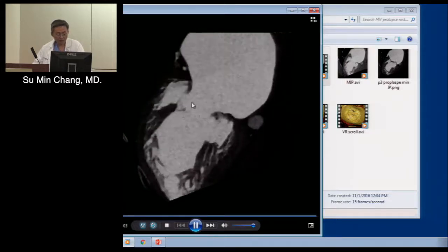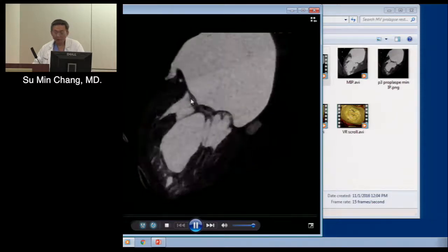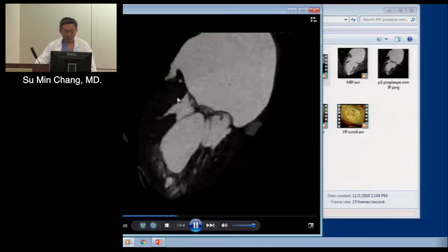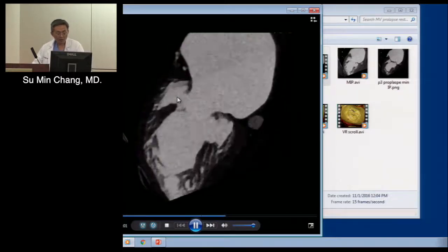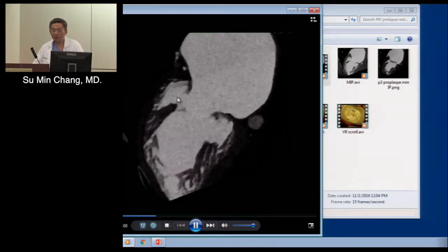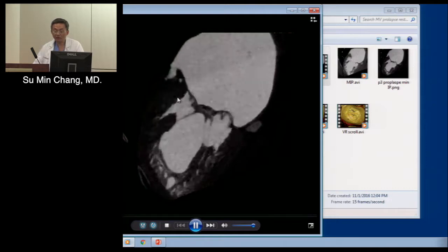This is rare, but one of the best examples we have, where you can even see the chordae. Someone is nodding their head because I think I gave her this picture. This is important because for mitral valve assessment, the limitation we have with echo, or the TEE especially, is that the subvalvular apparatus is in the far field.